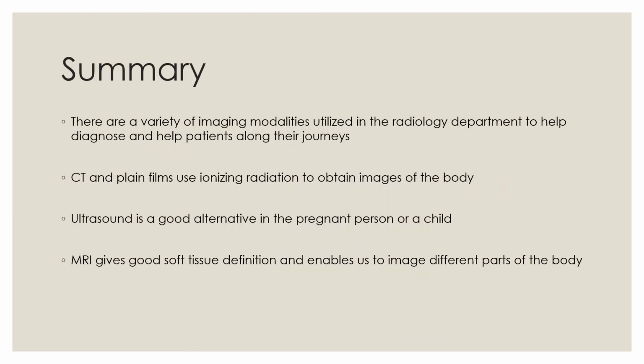So in summary, there are a variety of imaging modalities used in the radiology department to help diagnose and help patients along their journeys. CT and plain films use ionizing radiation or X-rays to obtain images of the body, and are generally our workhorse forms of imaging. Ultrasound is a good alternative in a pregnant person or a child, and MRI gives us very good soft tissue definition and enables us to image different parts of the body.